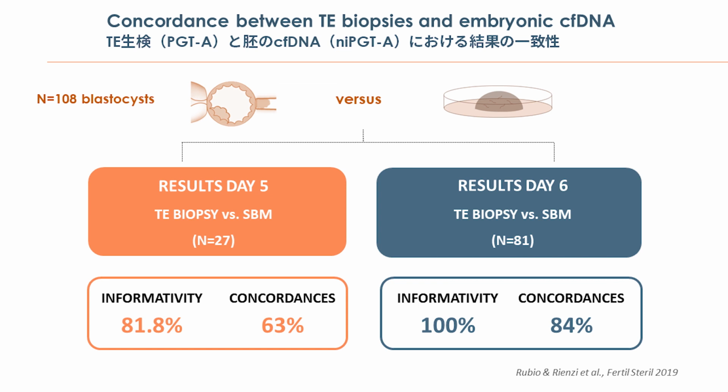However, if we collect the media on day 6, the concordance rate was 84%. And this is very close to the previous publications in which they were manipulating the embryos in some way. So we demonstrate here that without touching the embryos, just by cleaning properly and culturing in a small drop, taking care of external contamination from the technicians in the lab, trying to cover with masks, with gloves, trying to work in good conditions in the IVF lab, we can decrease contamination and we can have this good concordance rate. And this is the concordance rate with the trophectoderm biopsy.